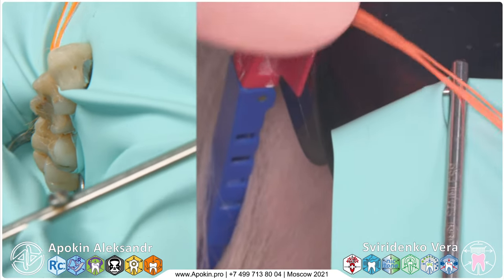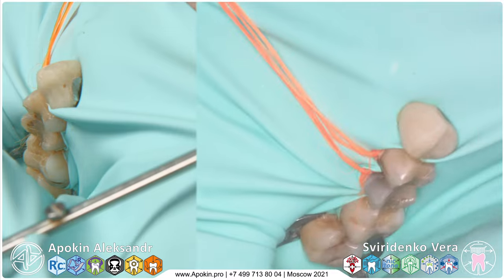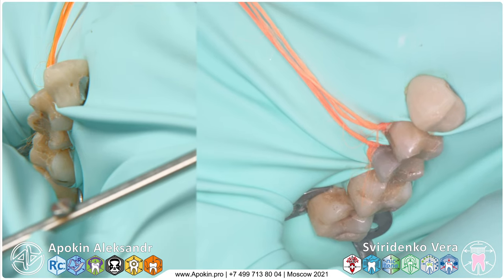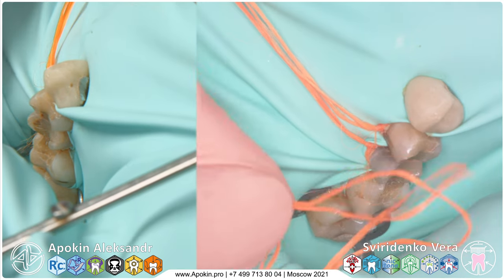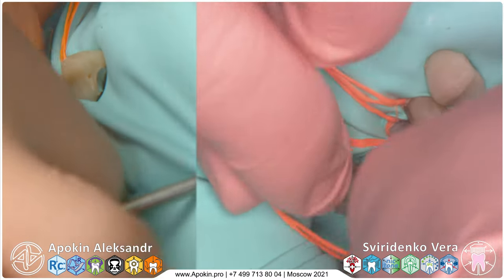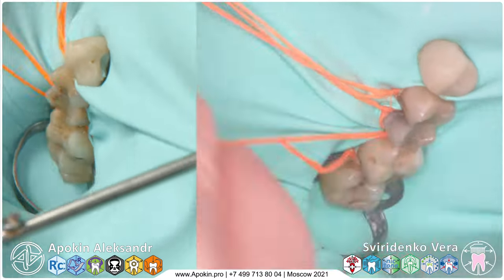Utilization of the ends of these ligatures around this angle of the frame. The last ligature for 16. Searching the distal interdental space and fixing this ligature.